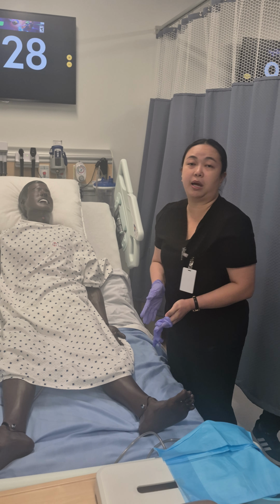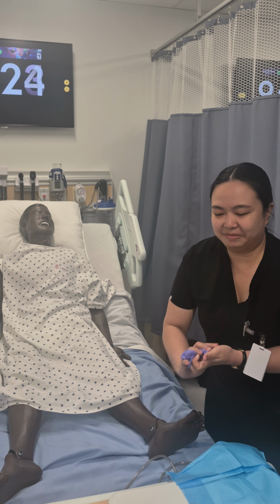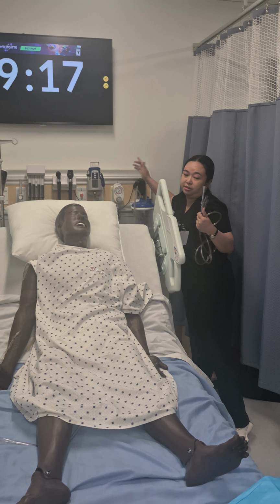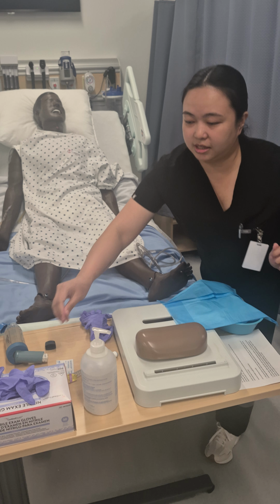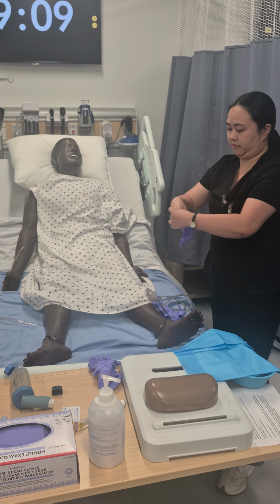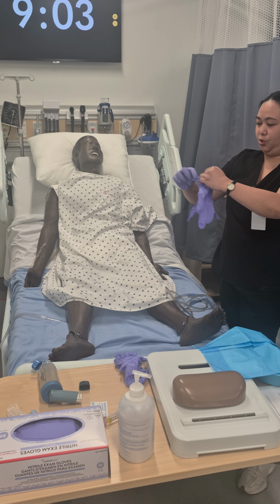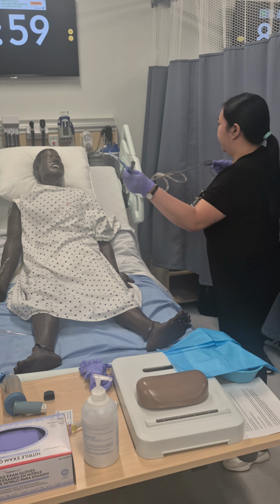I'm just going to set up by doing hand wash. I'm just going to set up first the wall suction. Just check if it's working well. And I'm going to do hand washing. And then I'm going to put on my gloves. Then connect this to the wall.